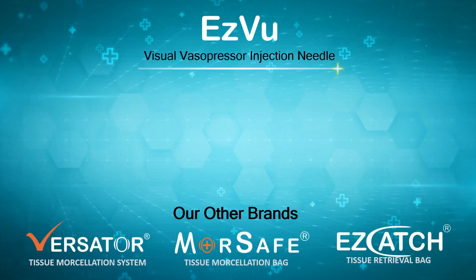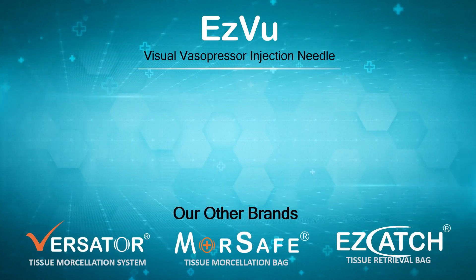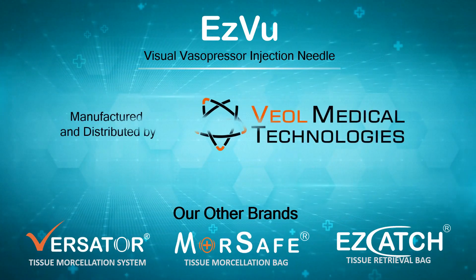EzVu Visual Vasopressor Injection Needle — manufactured and distributed by Veol Medical Technologies, India.